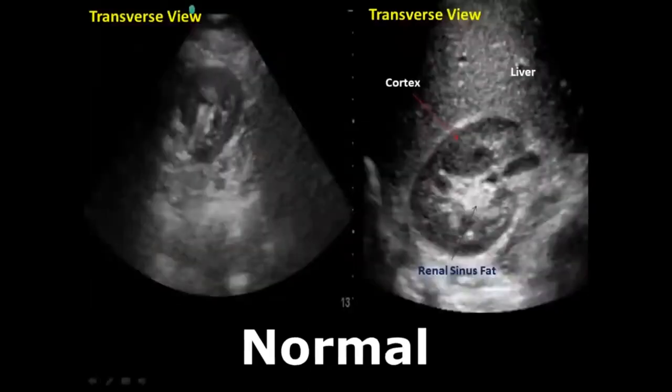Next view is the transverse view. It is a cross-sectional image of the kidney, and in the right image we can see it more clearly. We have the cortex and the renal sinus very well visualized, and above them is the liver. And here we can see some of the renal pyramids, and we can also see the renal pelvis.